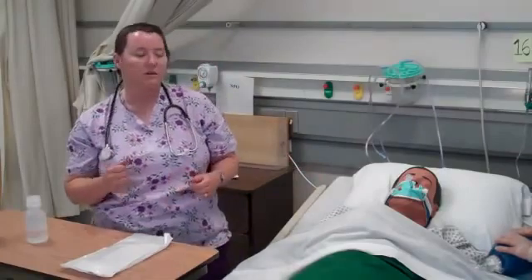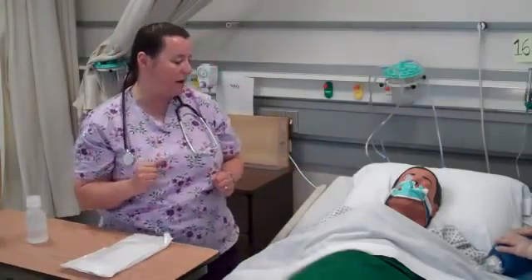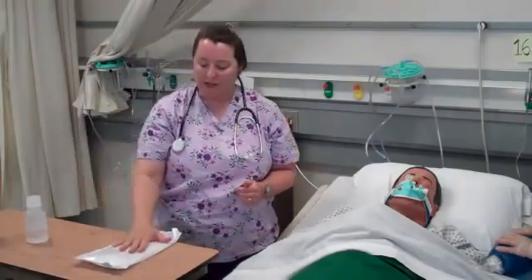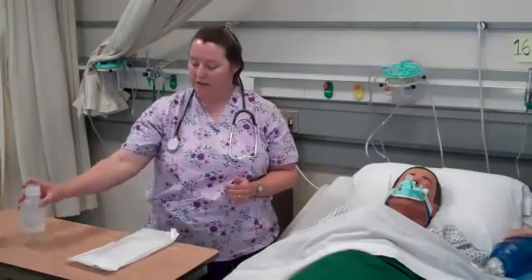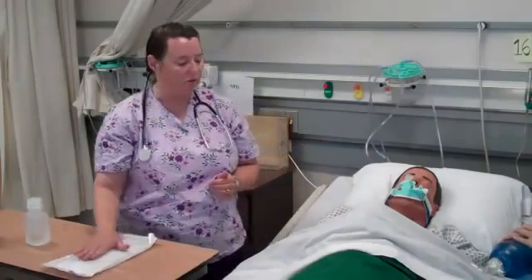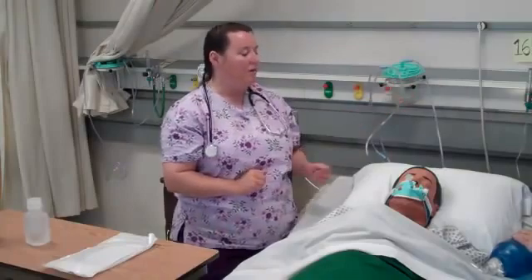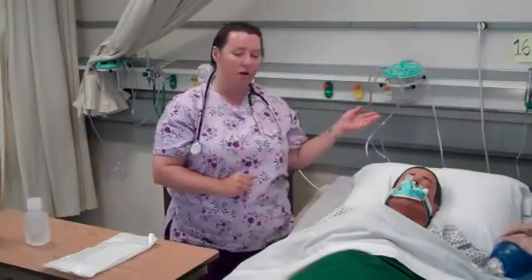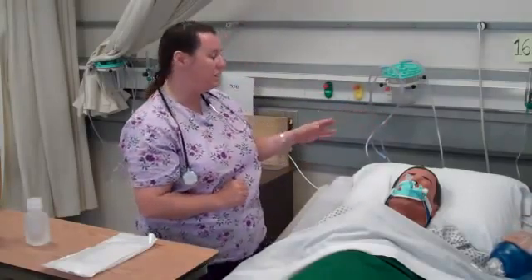The patient's condition warrants suctioning and my doctor's order authorizes me to do that. I'm going to gather my equipment: I need my suction catheter kit, a container for saline, and sterile saline — this is a sterile procedure. I also want to make sure I have an oxygen source available, as the patient is currently on a ventilator and we need to give supplemental oxygen between suctioning passes.